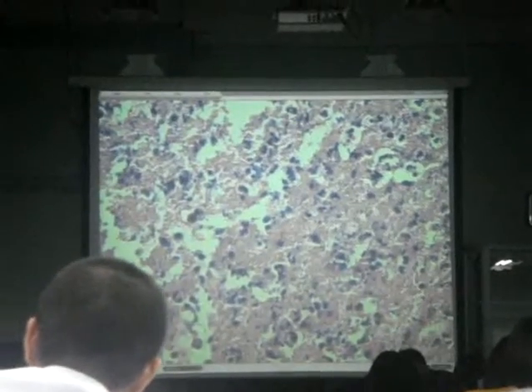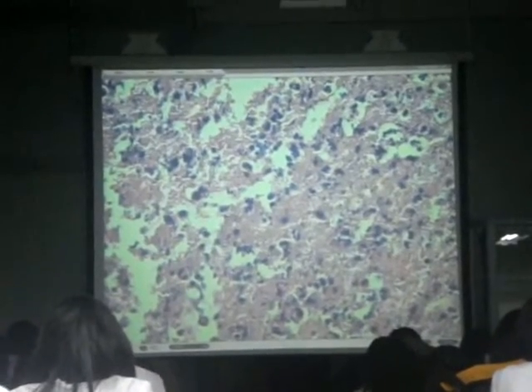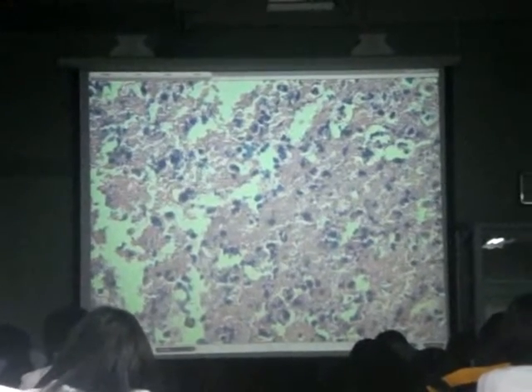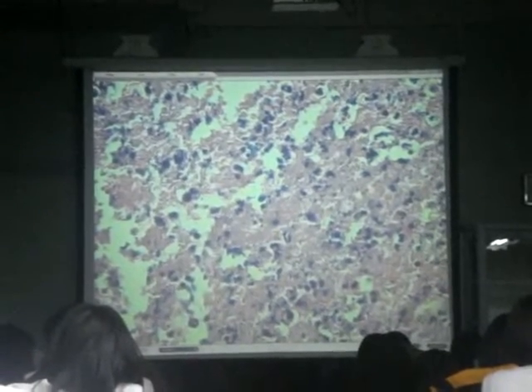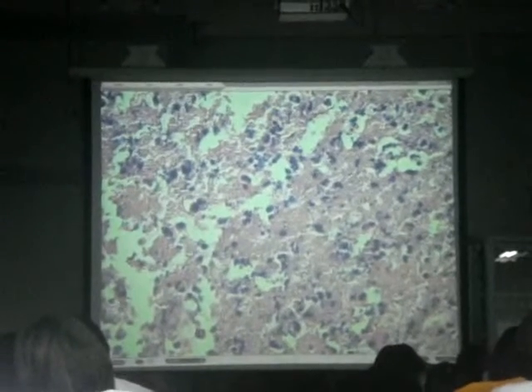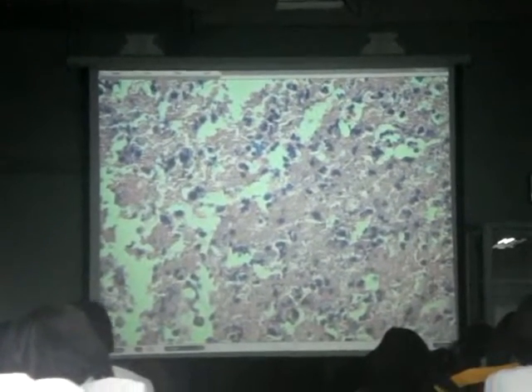These are mere eosinophilic granular tissues peppered with inflammatory cells. So these are lymphocytes and plasma cells. And the big thing is, are necrotic debris. So, ito yung mga pinagtirahan at nabulok-bulok na tissues. Okay? No more form. No form, no nuclei. The black ones are not nuclei of these tissues. Those are inflammatory cells.